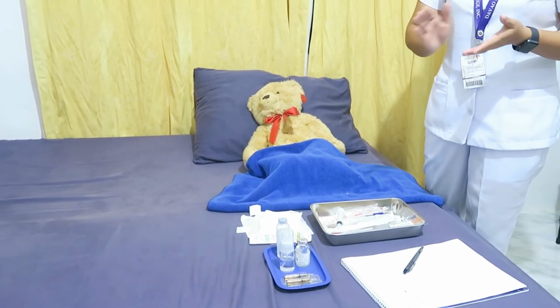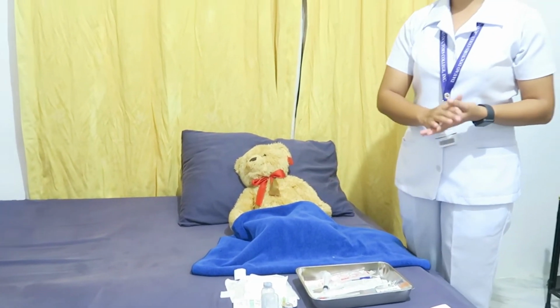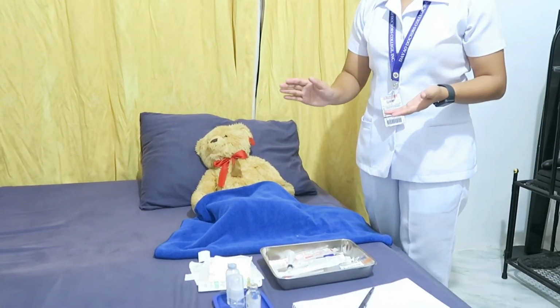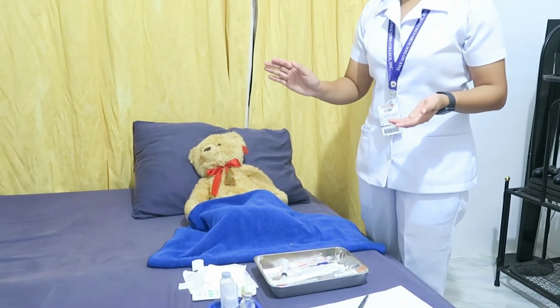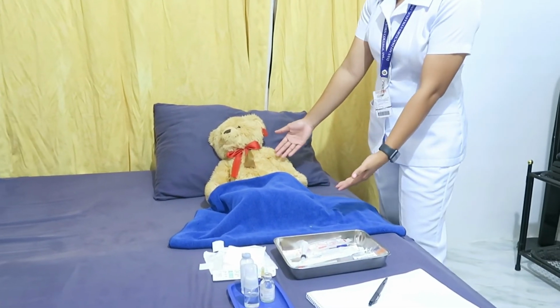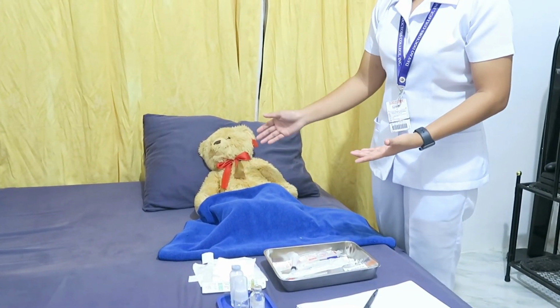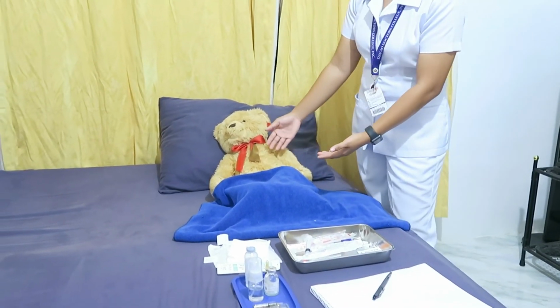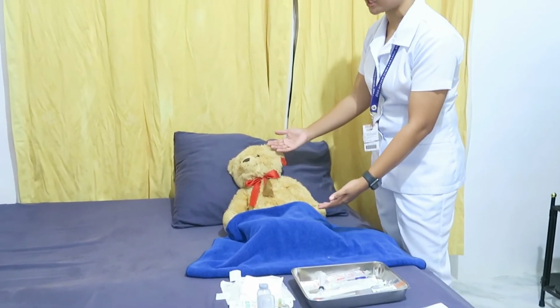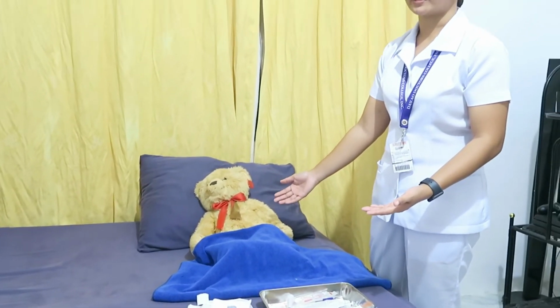So, after that, assist the client to a supine, lateral, prone, or sitting position depending on the chosen site. If the target muscle is the gluteus medius or the ventrogluteal site, have the client in a supine position. Just like that, flex the knee. Then, in the lateral position, flex the upper leg, and in the prone position, toe in. So, as you can see, my patient is already in a supine position and her leg is already flexed. The rationale for that is the appropriate positioning promotes relaxation of the target muscle.